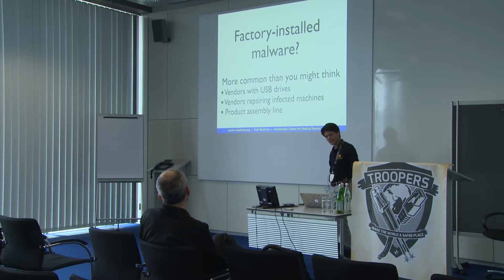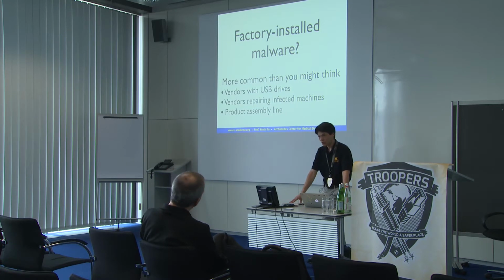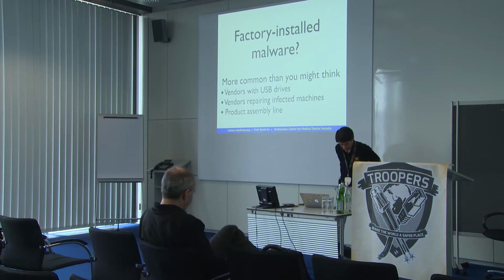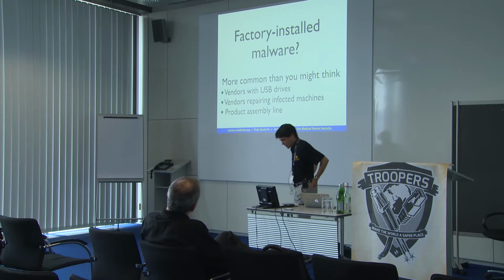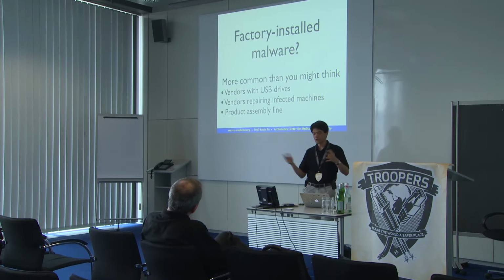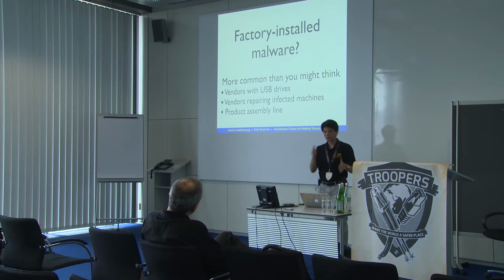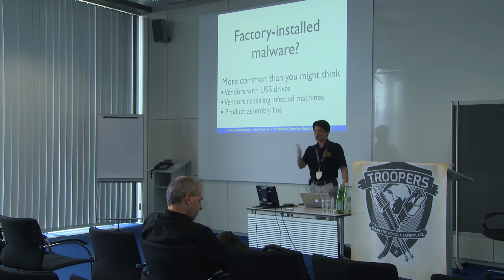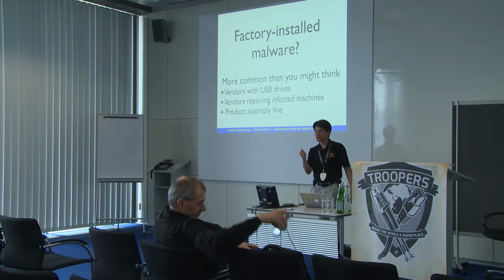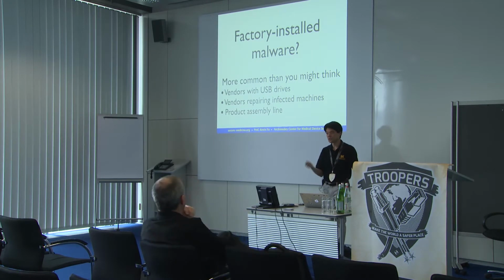But how does malware get in? I was surprised to learn. So I talk a lot with physicians, and they tend to send me their war stories. One of the most common war stories I'm picking up is vendors that install malware by accident. There was one story by a woman from the Veterans Administration in the US. So there are 150 or so clinics that serve veterans in the United States. One day she was watching her intrusion detection software and she just saw all these intrusions pop up. And it corresponded exactly with the vendor who was going around with a USB stick updating the firmware on medical devices. So this third-party contractor was actually the source of the infection in their hospital.